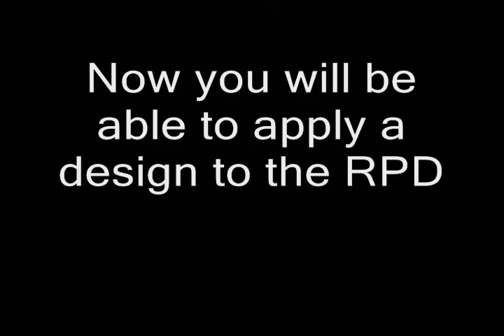Now that you have completed the surveying, you will be able to apply a design to the partial denture. You will be able to plan tooth reductions with respect to guiding planes, axial reduction, and rest seat preparation. You will be able to plan your clasps and your major connector placement. It is very important to recall that your partial denture design must work with the patient's existing occlusion. Therefore, you should re-examine your design on a mounted cast to ensure its adequacy.